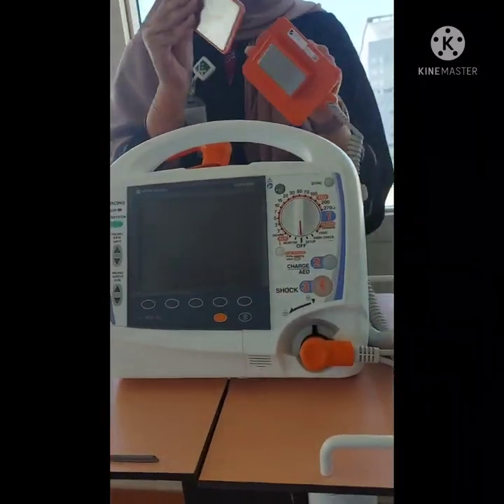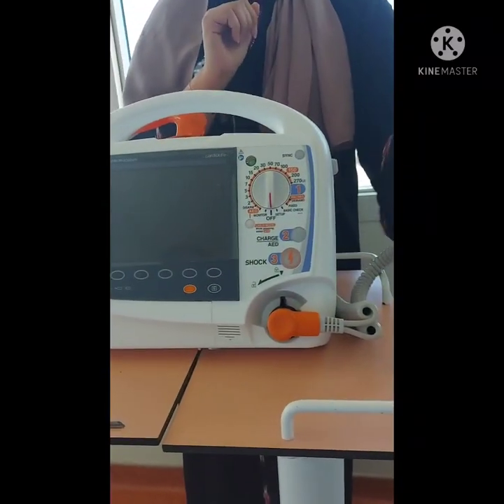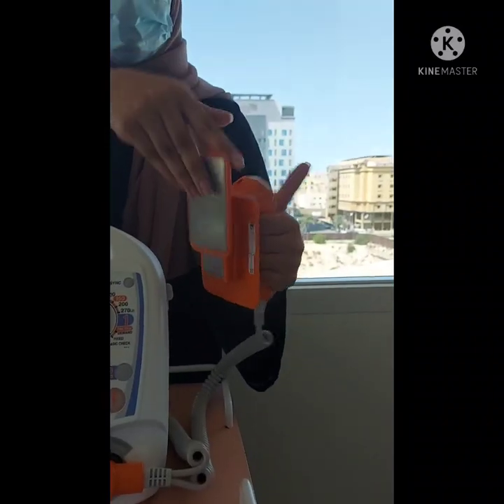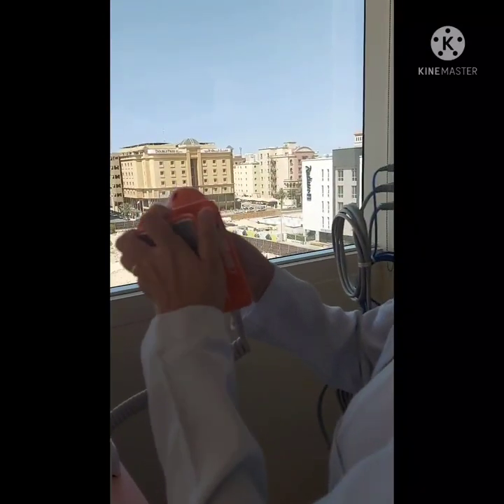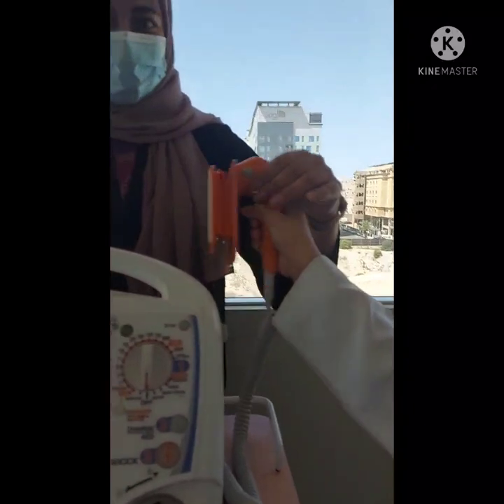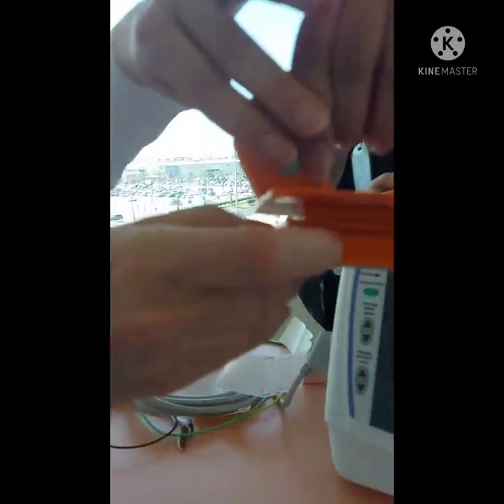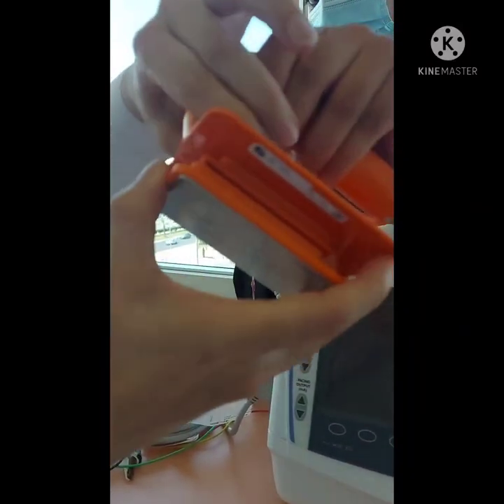Much better. Nice. The other one, it's so hard. Can you remove it again? How? Just press. Nice. Then put it back. Put it and... can you try? Okay. Yeah, sure. Wow. Yeah, wow. Oh my god! Yeah, easy. Just press that one. Press and pull. And then push again.